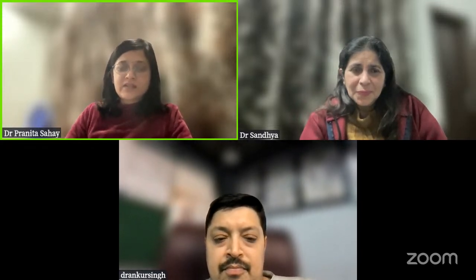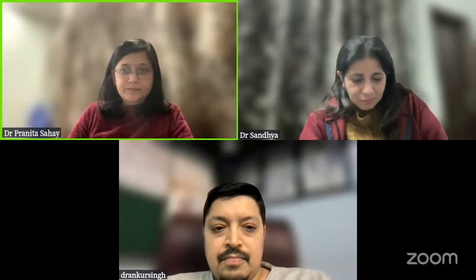Okay. Yeah. There's another question: a lot of times CR thickening, CRT, is mentioned when ultrasound scans are done. So how to make an interpretation about the CR thickening, chorioretinal thickening? That you can do once we have a combined A scan. This is the importance of having a combined A scan. If you are purchasing an ophthalmic machine, always insist on a machine with a combined A scan. Only that will give you measurements, and that is actually very useful.